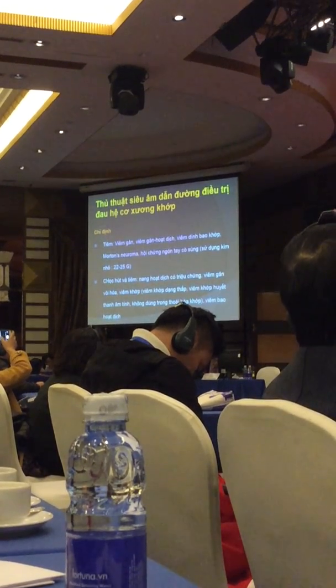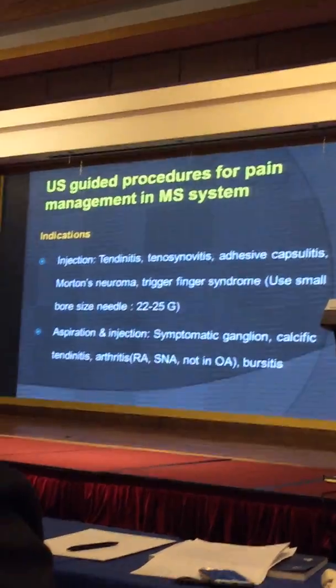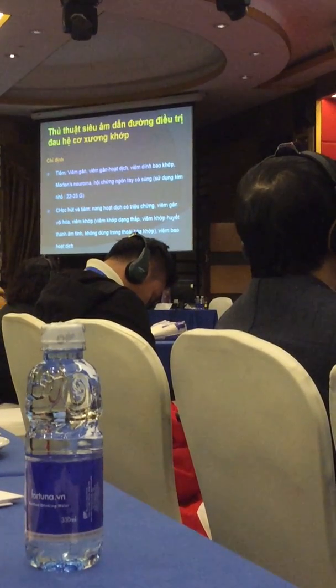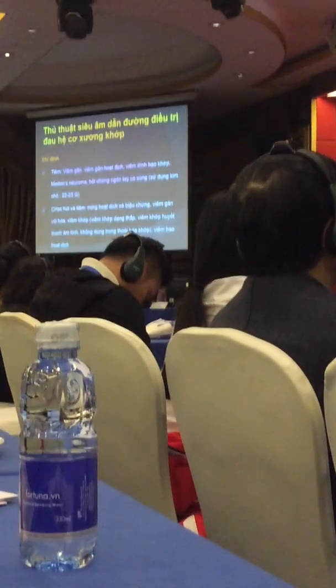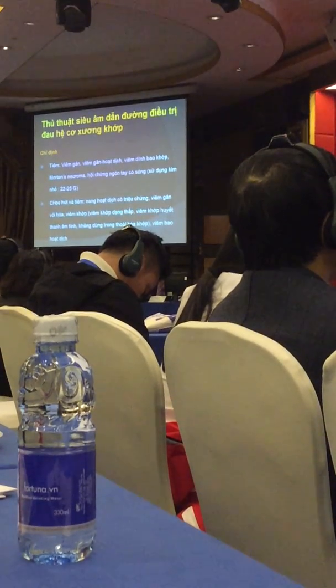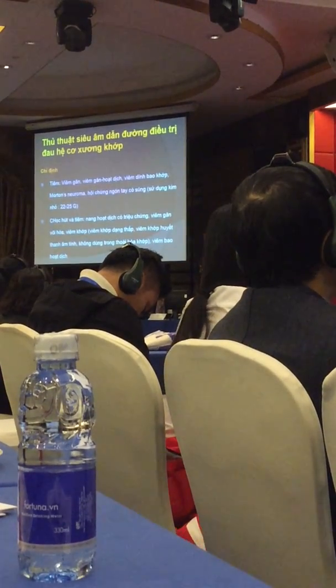You can do injections for tendinitis, tenosynovitis, adhesive capsulitis, Morton's neuromas, and trigger finger syndrome. You can use small bore size needles, especially for small structures. Aspiration and injection can be done for symptomatic ganglions, tendinitis, and arthritis, as well as bursitis.